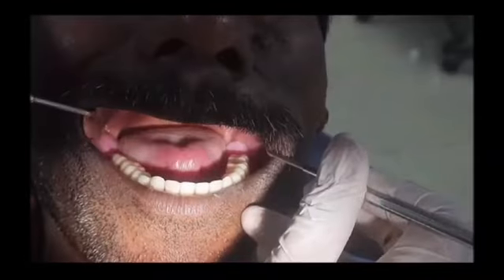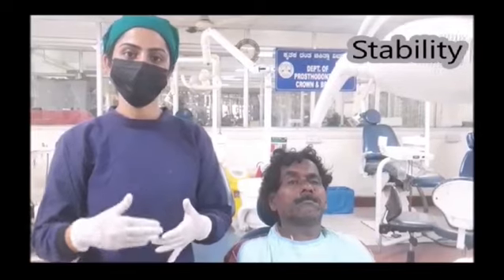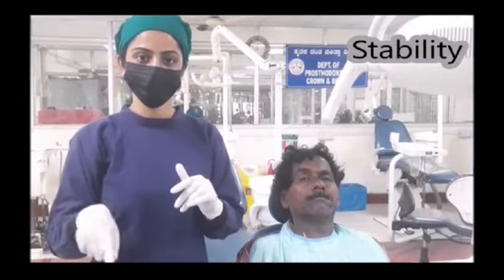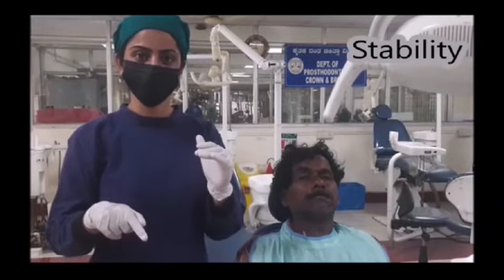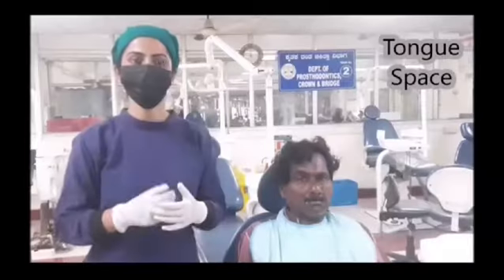Then the posterior extension is evaluated by checking the extension on the retromolar pad region. Stability can be checked by applying pressure on one side of the arch on the premolar and molar region. If there is a rise, it indicates instability. Here pressure is applied on one side of the arch. There is no rise on the other side, which indicates stability.